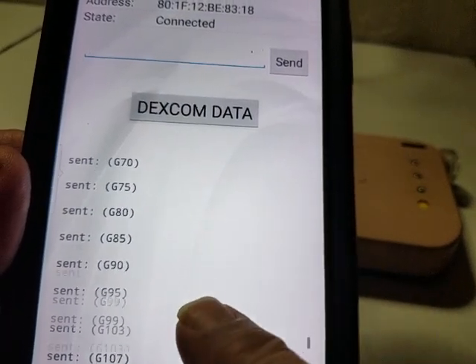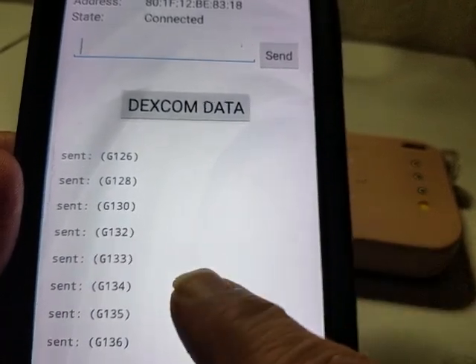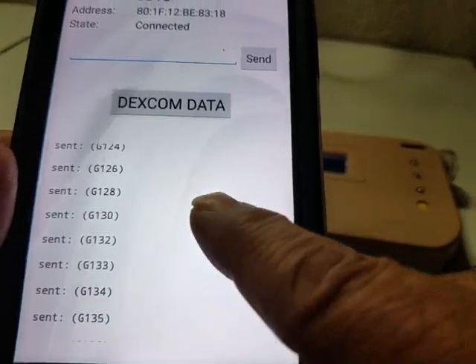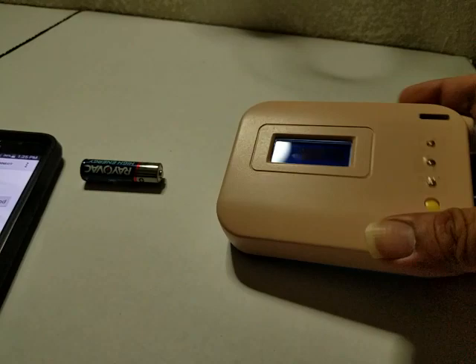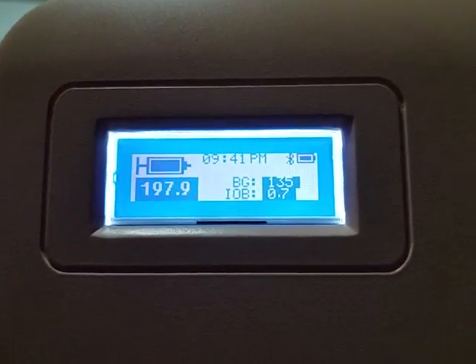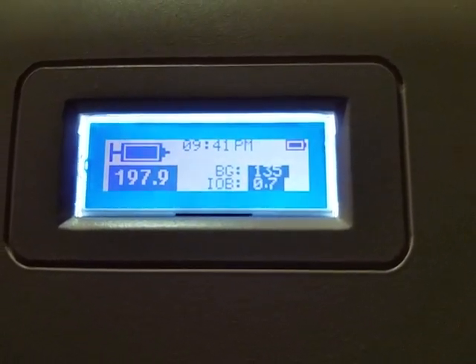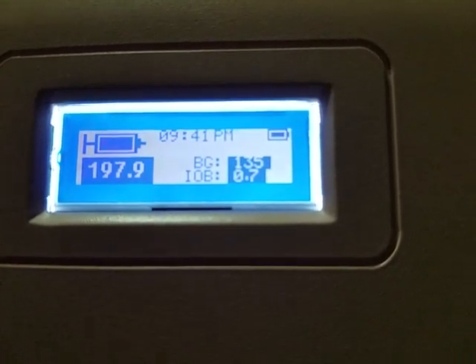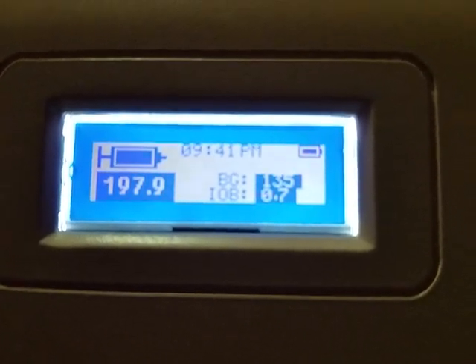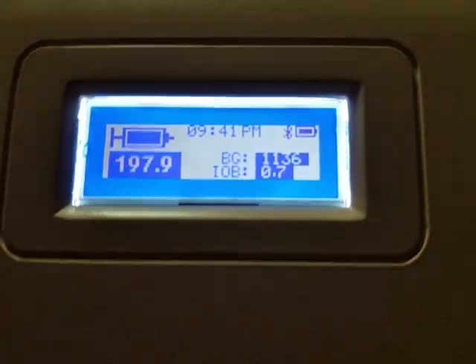The number has been going upward from the 39, you remember. Now it's 136. Going back to the pump — it's 135, and the ISF was 38. Now you see the pump did a 0.7 insulin dosing. That's how the closed loop basically works. We're going to monitor this as the number goes up.